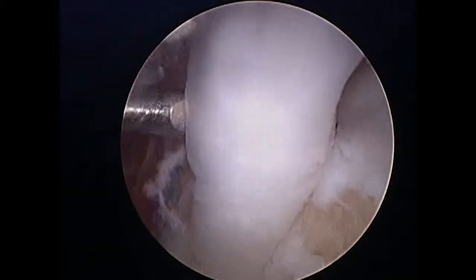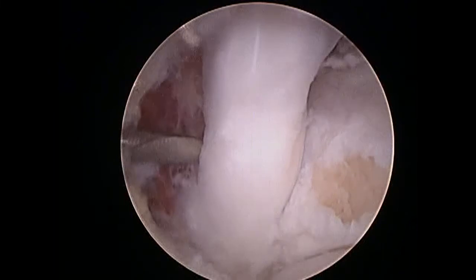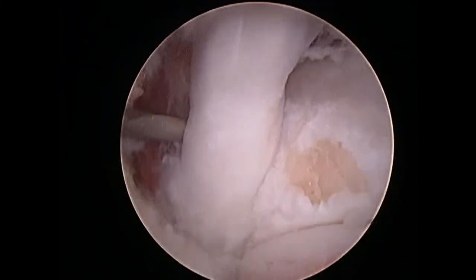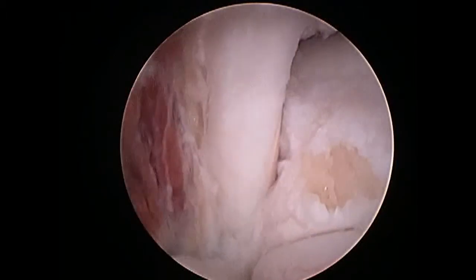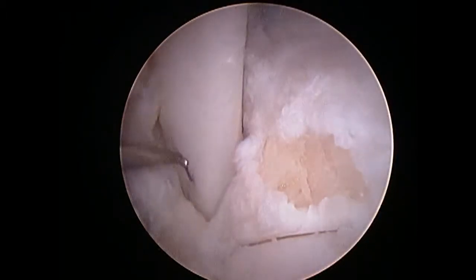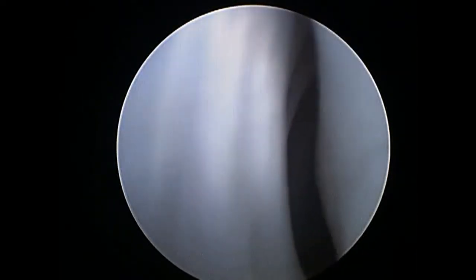The FHL tendon is visualized here. Caution must be taken at this point, as the neurovascular bundle lies just medial to the tendon. We can see that the tendon has lost its normal striations due to stenosis. The FHL tendon must be inspected fully and carefully, as studies have shown that up to 85% of patients undergoing surgery for hindfoot pain have some degree of FHL tenosynovitis.